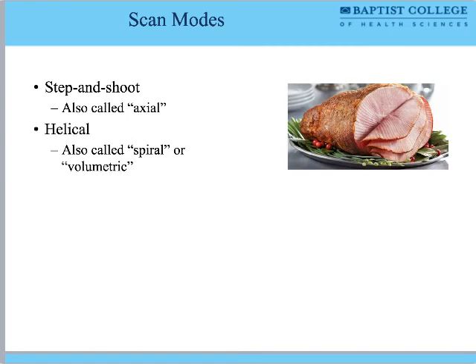Yes? In radiation therapy, like the external beam, I've seen them say the same thing, step and shoot, in some of the treatment plans. Is that the same thing? It probably is. I'm not super familiar with the cone beam CT stuff that's done. But I would assume that a radiation therapy gantry would have a very difficult time doing helical scan modes. It would have to do an axial scan mode, just because of how big that machine is.